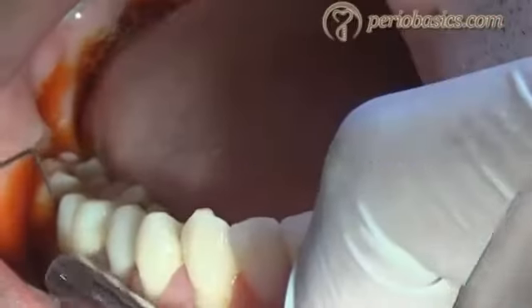Now the modified flap operation was introduced by Kirkland in 1931. This is one of the most conservative procedures, which preserves the healthy tissue because it aims only at removal of the pocket lining. This is why this procedure is done most commonly on the maxillary and mandibular anterior areas, because they are of prime aesthetic concern. So now let us see how a modified flap operation is done.